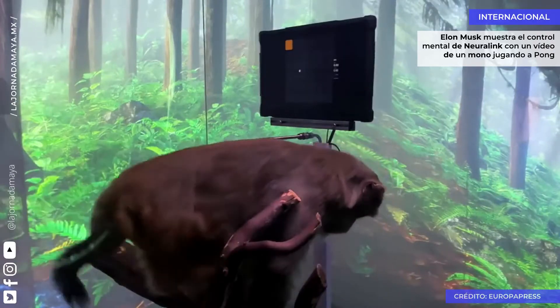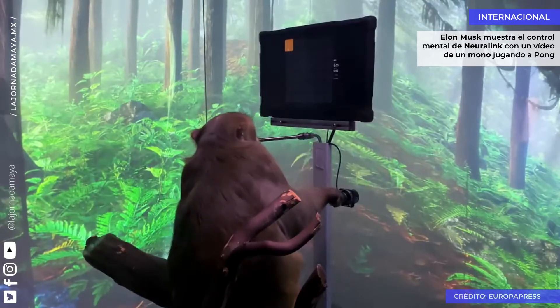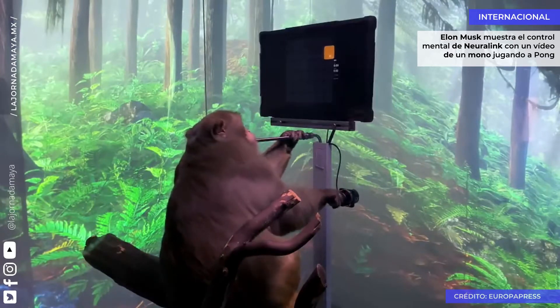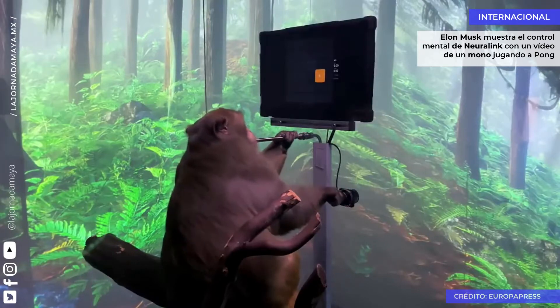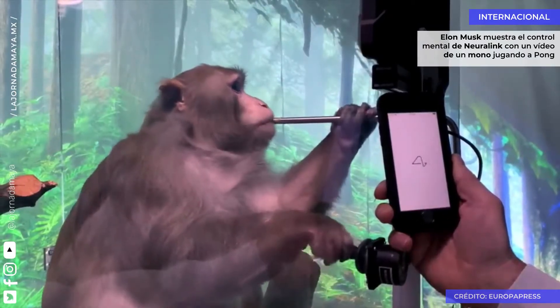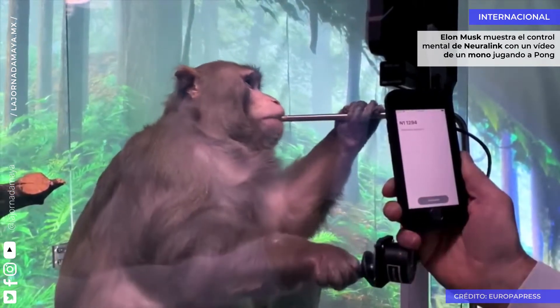He's a nine-year-old macaque who had a Neuralink placed in each side of his brain about six weeks ago. If you look carefully, you can see that the fur on his head hasn't quite fully grown back yet. He's learnt to interact with a computer for a tasty banana smoothie delivered through a straw. We can interact with the Neuralinks simply by pairing them to an iPhone, just as you might pair your phone to a Bluetooth speaker.